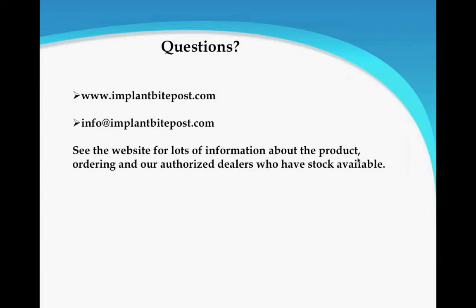Another one came in. This pertains to what Mark was saying. If I have a multiple unit case, do I need to use every implant fixture for the bite? How many, and what location should I use? No, you don't. It's just like a bridge. Let's pretend that you did a traditional ceramic metal bridge for 13 through 15. The dentist would take the bite on 13 and 15 if there was a pontic. Same thing: if you had 13, 14 and 15, you only need to use 2. So you don't want to get carried away with that. It's unnecessary.